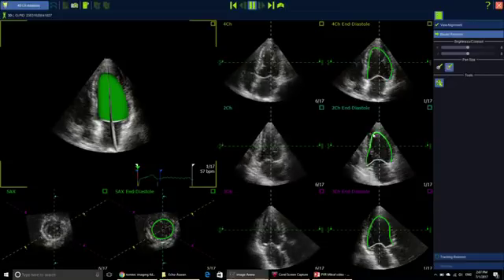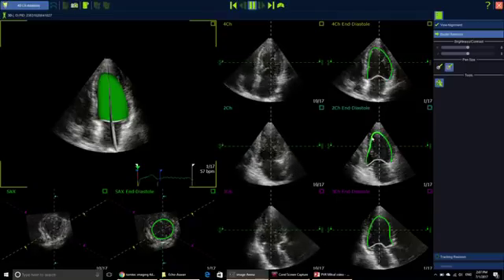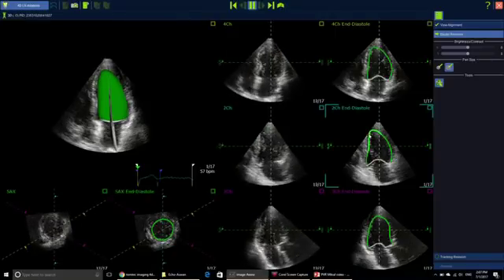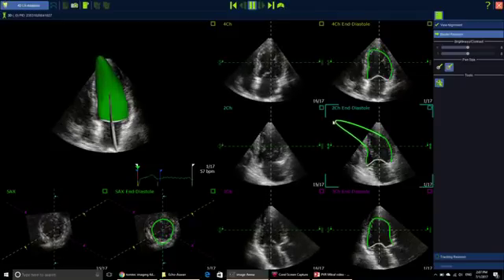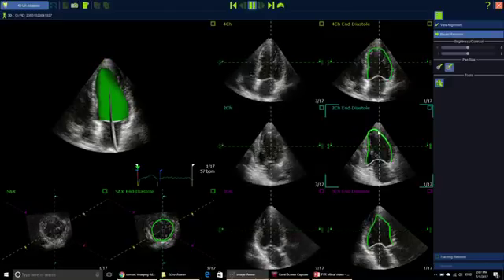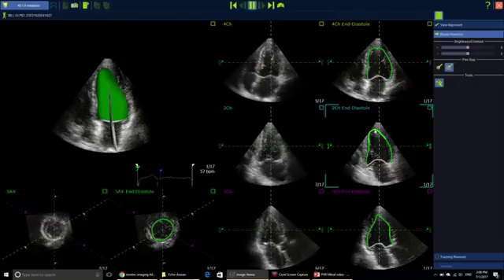For example, here I cannot see the apex tracked very well. I can come here — once you move the mouse nearby the line it will be highlighted. The highlighted part is editable, so once it is highlighted I can click and hold and then pull it up or put it down. If you notice, the image on the other side is changing instantaneously. In other softwares, in order to edit anything you have to start over again from the very beginning, but in this very smart software you can edit even after the finalization of the results and everything will be recalculated again.